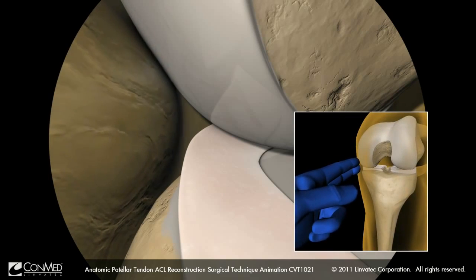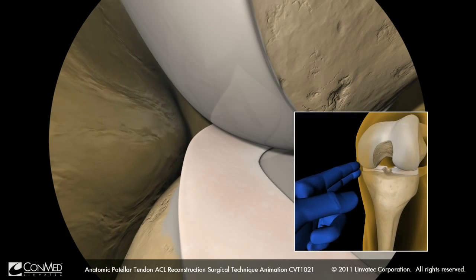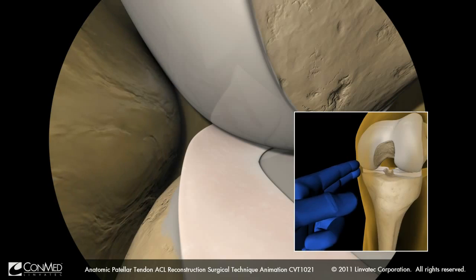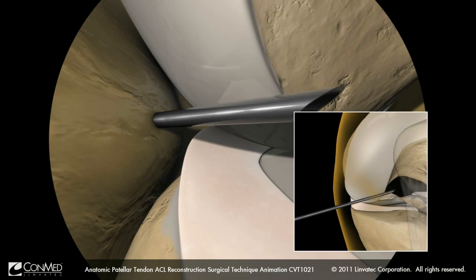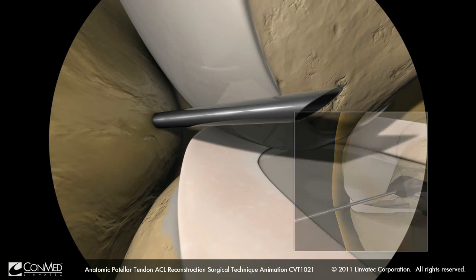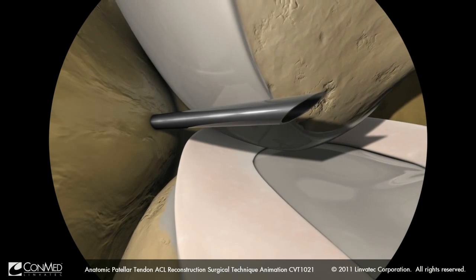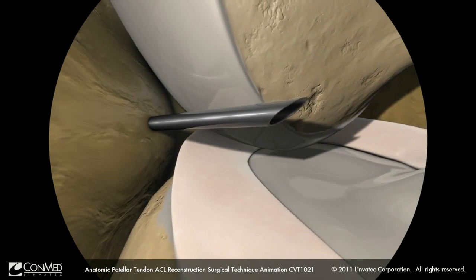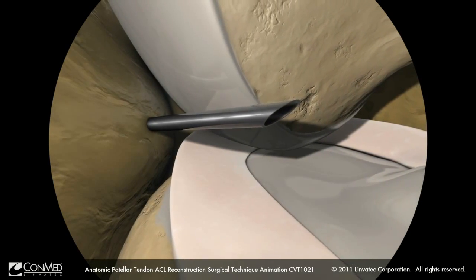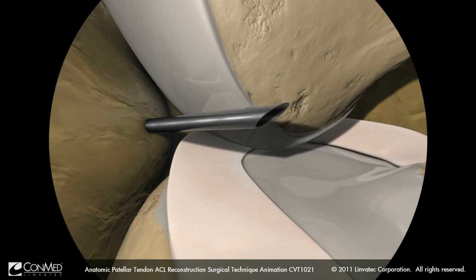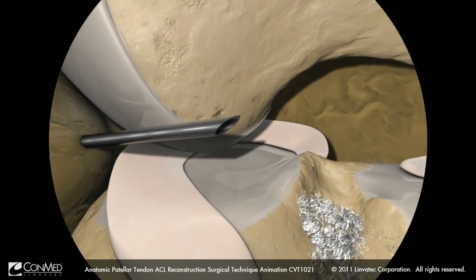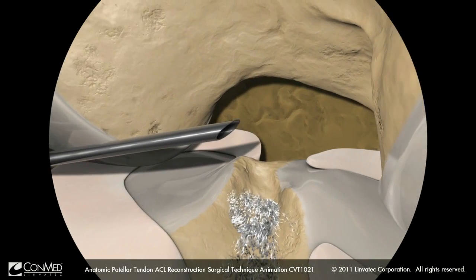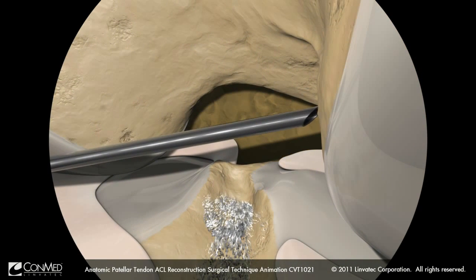With the knee flexed at 90 degrees, palpate the medial joint line. Under direct visualization, insert a needle anterior to the medial femoral condyle and above the medial meniscus to avoid damage. The needle should be directed towards the intercondylar notch. Advance the needle to confirm access to the femoral footprint of the ACL.